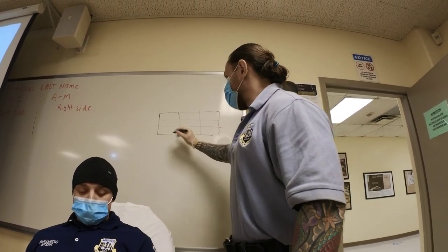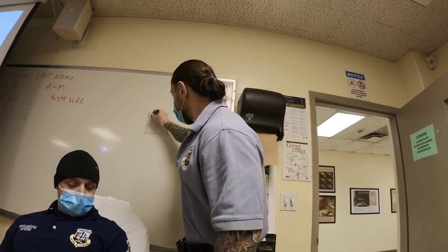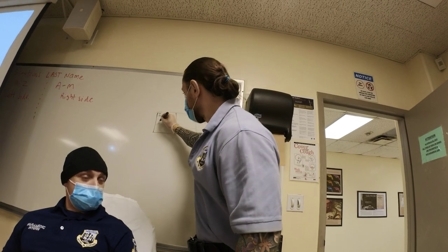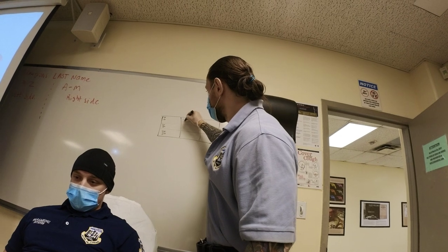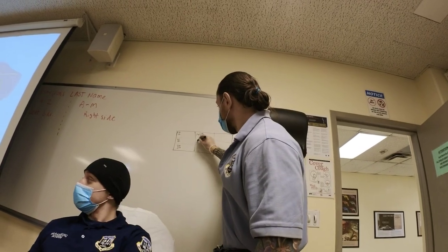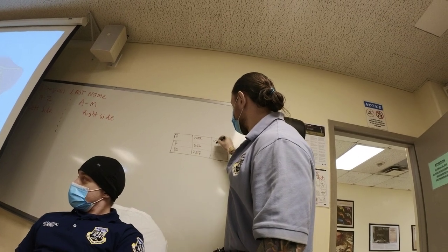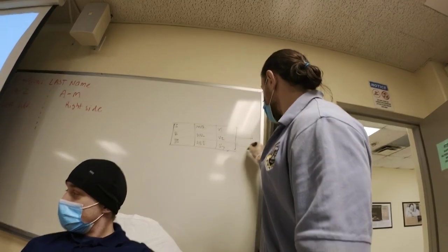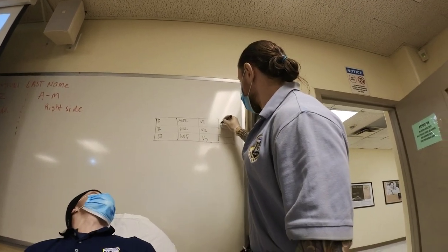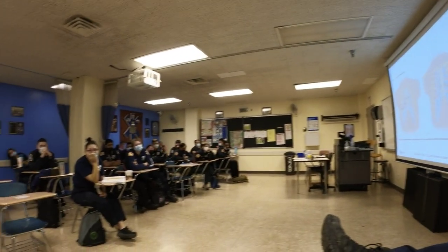Let's see if you guys can tell me. In this corner, the first lead, what is the first lead? One. Good. What's the next one? Two. Next. Three. Right, V4. V5. V6. Good.